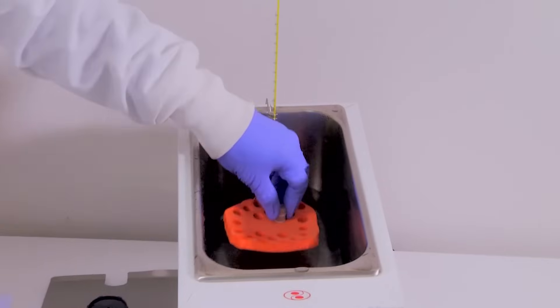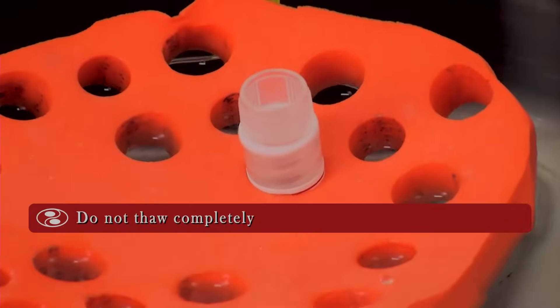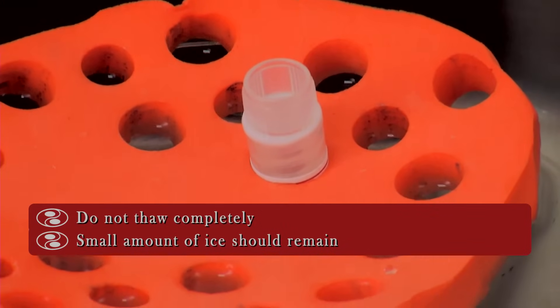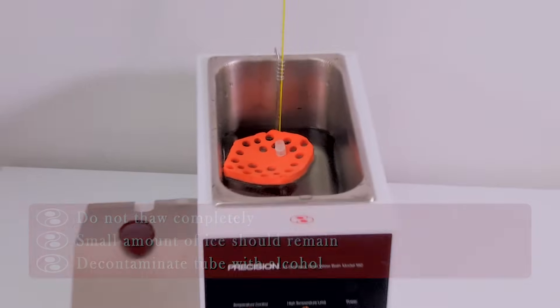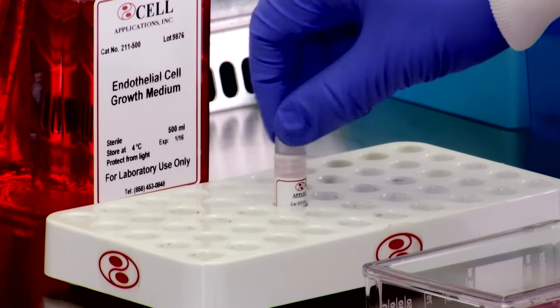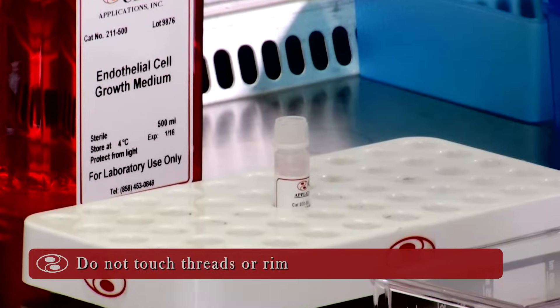Submerge lower half of vial in bath. Do not thaw completely. Small amount of ice should remain. Decontaminate tube with alcohol. Remove cryovial cap. Do not touch threads or rim.